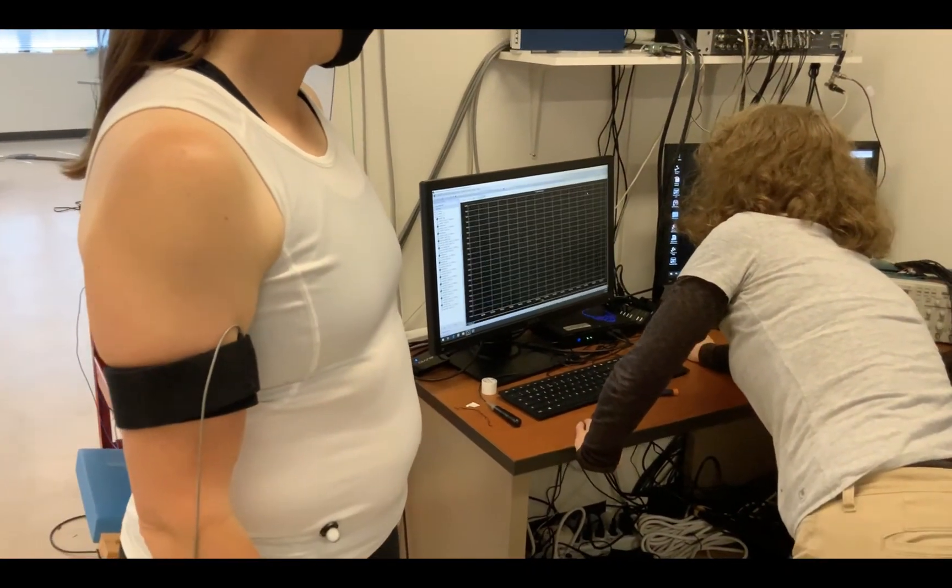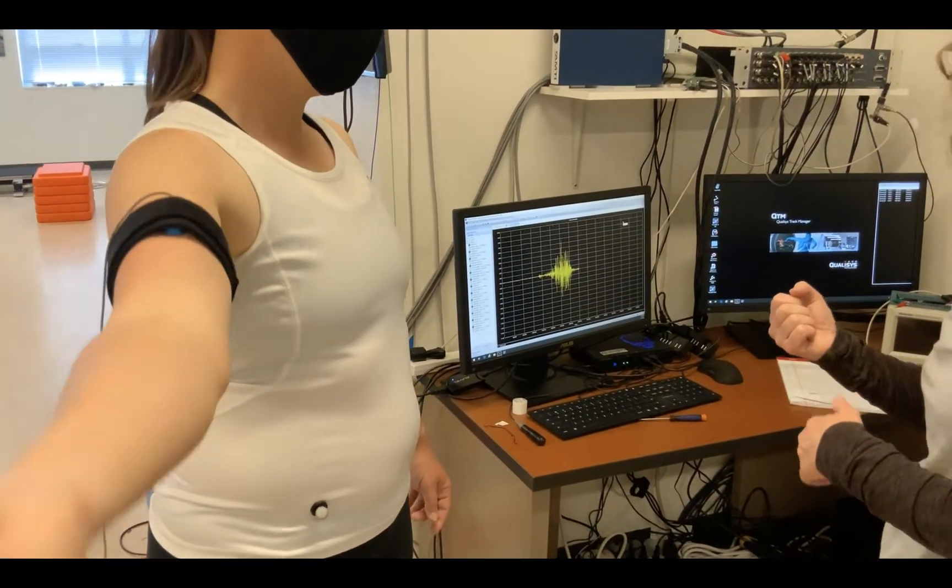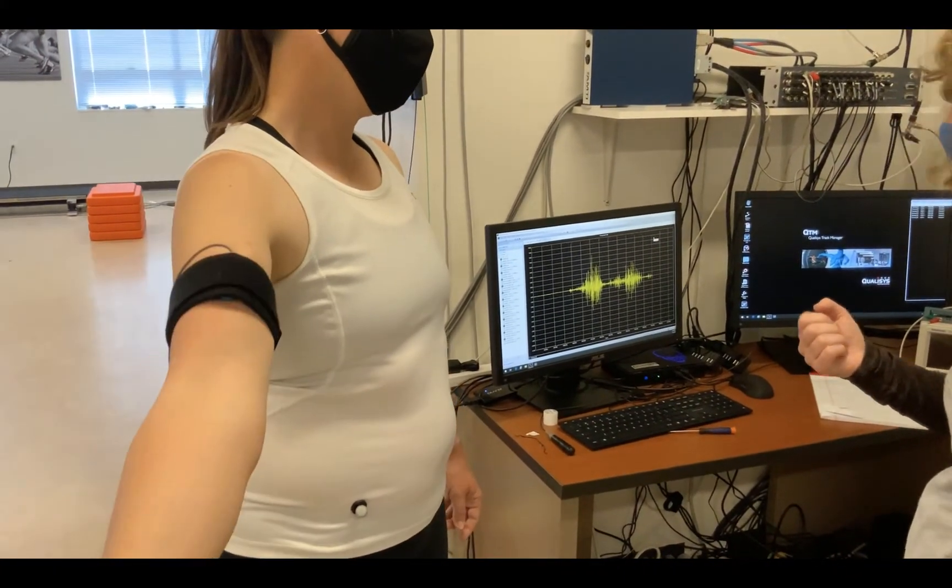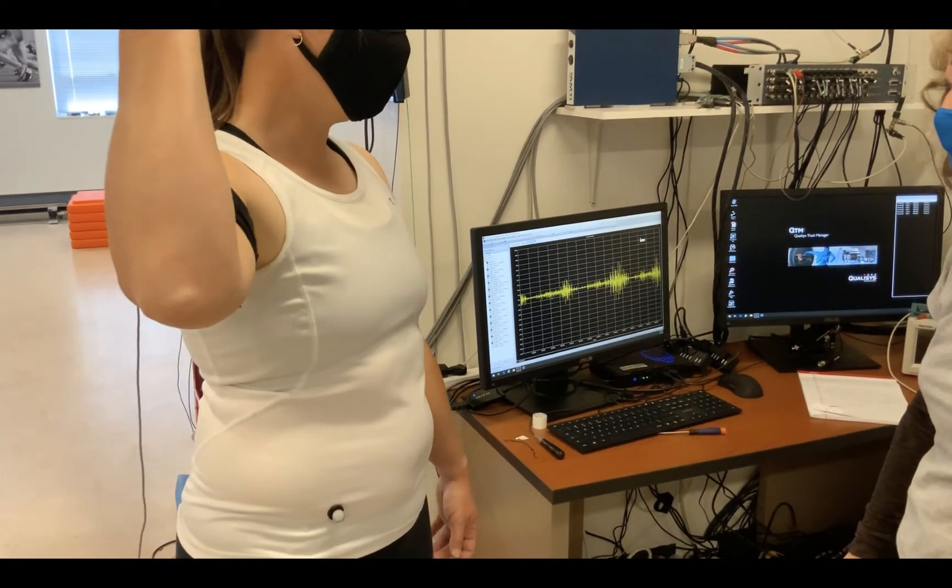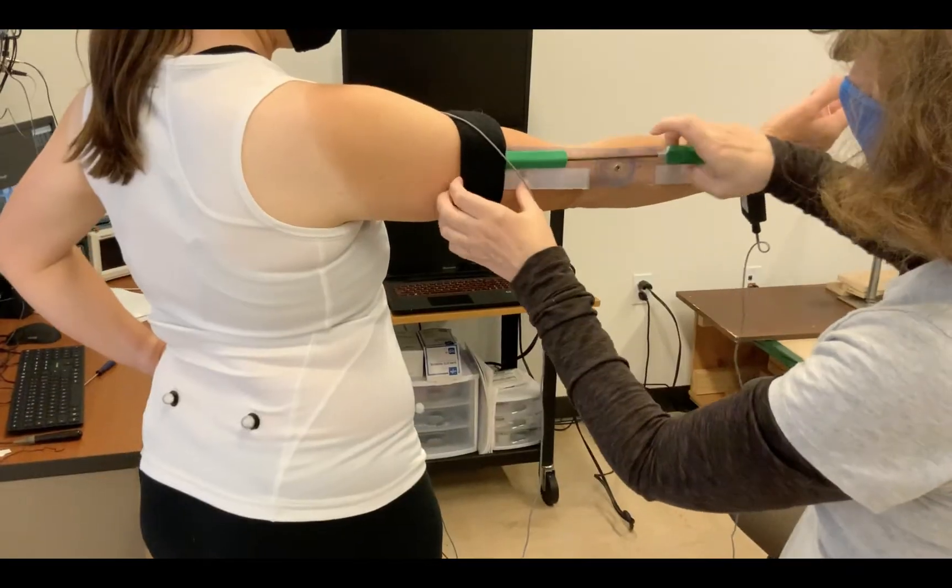Once you've got the sensor in place, you check to make sure that you get good data. So here the subject is flexing and you can see that as she flexes her biceps muscle you get a nice signal there, that noisy looking thing.